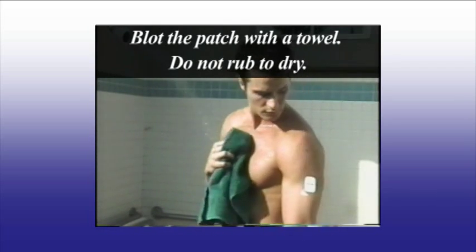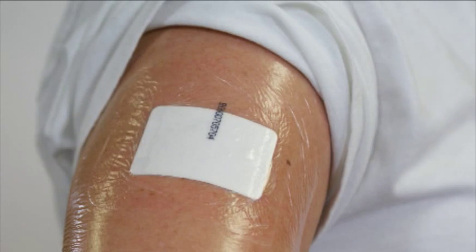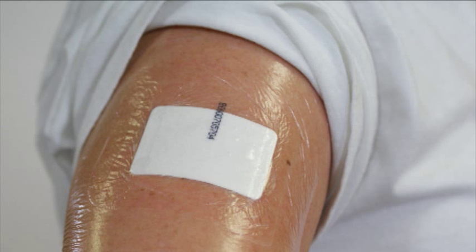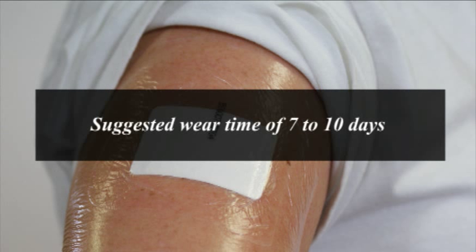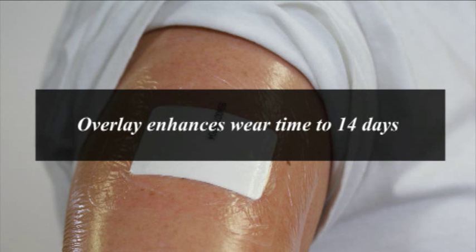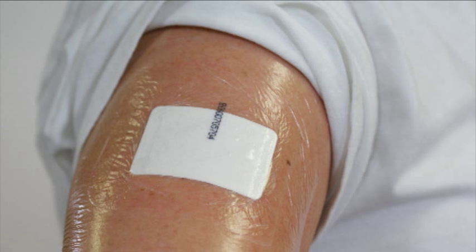The FarmCheck Sweat Patch is designed to be worn a minimum of 24 hours, which assures that enough sweat can be absorbed by the patch to provide a specimen for testing at the laboratory. We suggest a wear time of at least 7 to 10 days. To enhance and extend the wear time to as much as 14 days, we offer an overlay which is applied over the sweat patch. The overlay adhesive is made of the same components as the sweat patch.